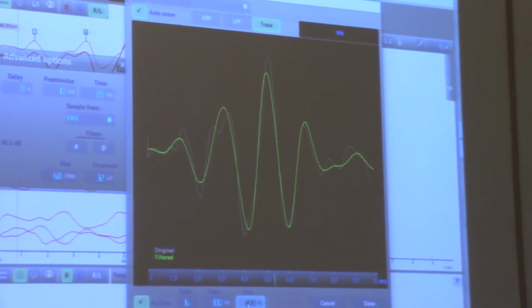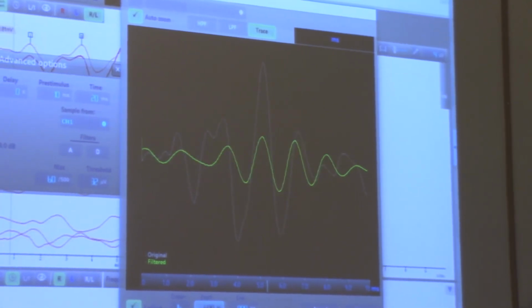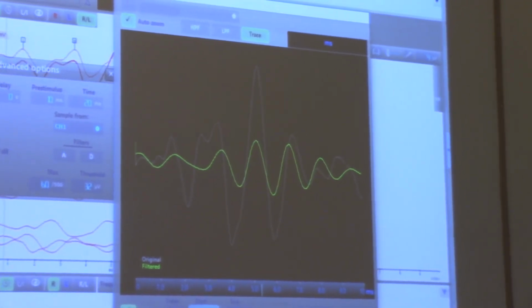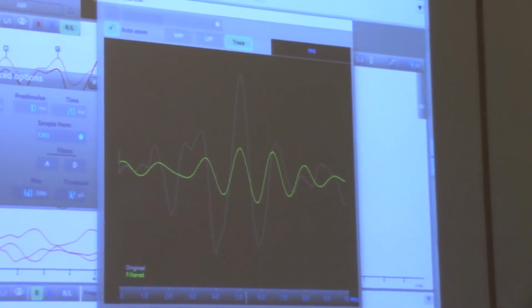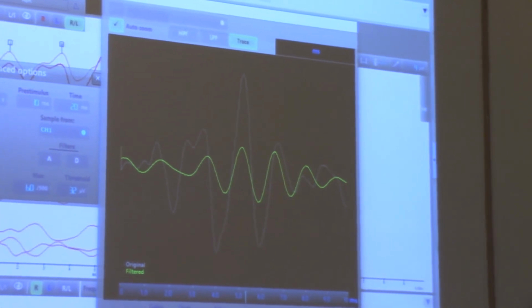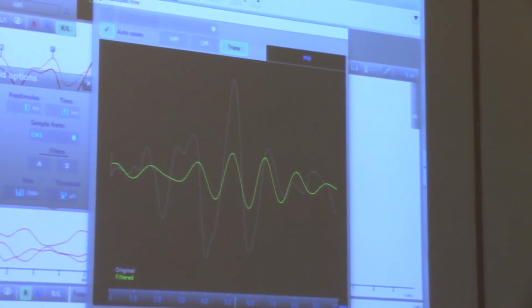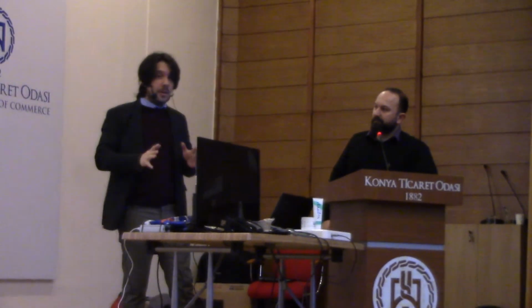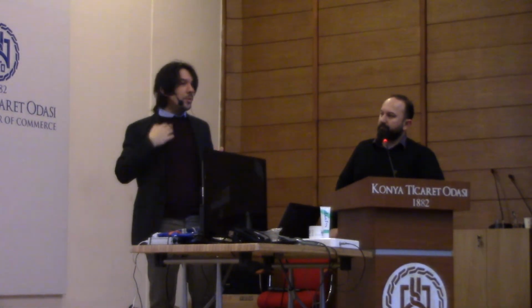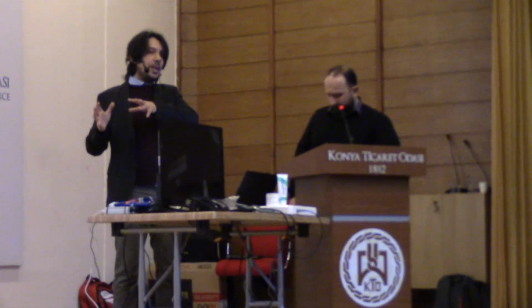Now at 800, the wave is starting to... If I increase this, yes, now I am at 600, I totally lost. This is probably the activity of our brain before our first coffee in the morning. It's nothing correlated with the stimulus, so this is a too strict filter band. But just to show you that when you contract the muscle, you are affecting the fifth peak typically.